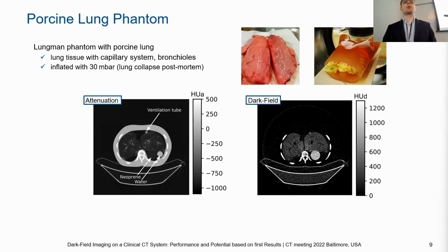I think that the problem here is that the flux we can generate is not high enough. Okay. So this is currently more of the issue for us, to apply enough flux, enough dose, so we can see something. Do you have a multi-energy system? No. Would you benefit from that?